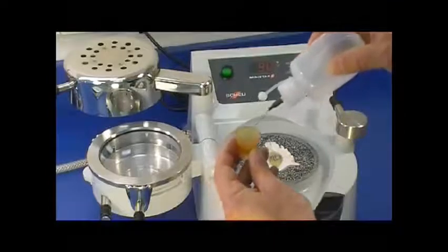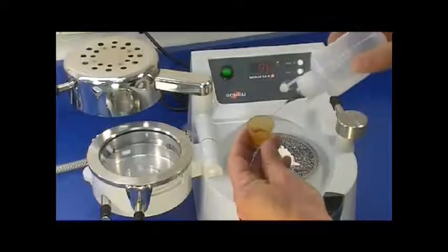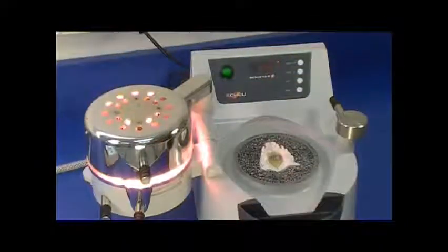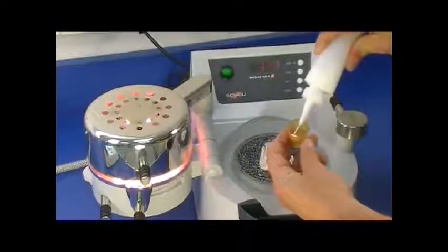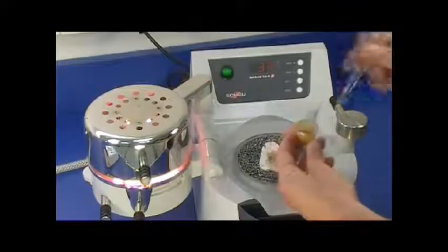Before heating cycle begins, prepare clear monomer within a small resin mix cup. Swing the lamp over the clamp material to start the heating cycle. With 40 seconds remaining in the heating cycle, mix polymer powder to monomer liquid in small resin mix cup. Resin mix should be maple syrup consistency.